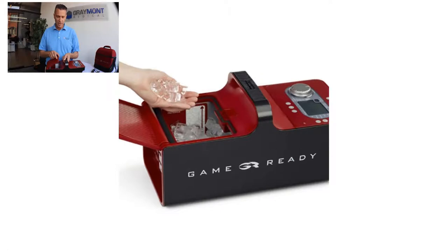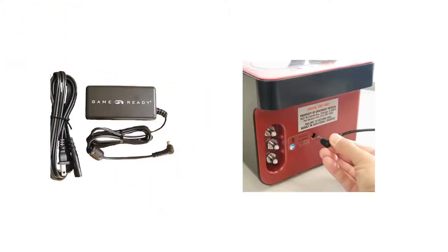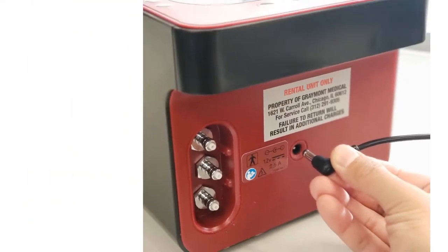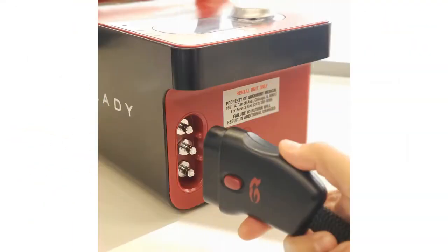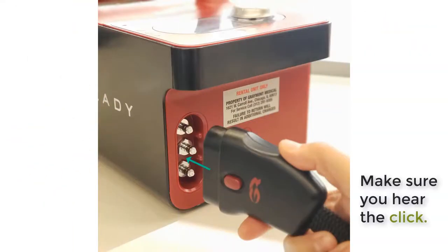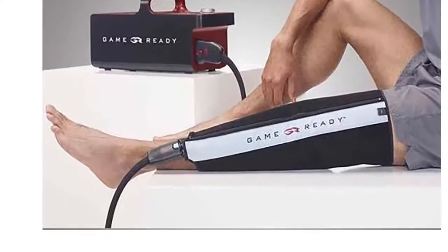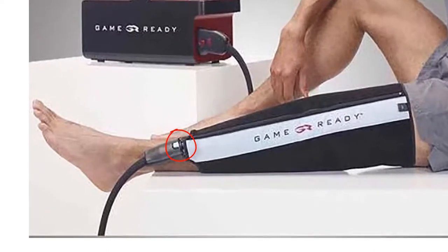Now close the lid, take your power cord and connect it to the power jack. Take the umbilical hose and push it inside the three-prong connection — make sure you hear the click. Take the other end of the hose and connect it to the wrap, and again make sure you hear the click.